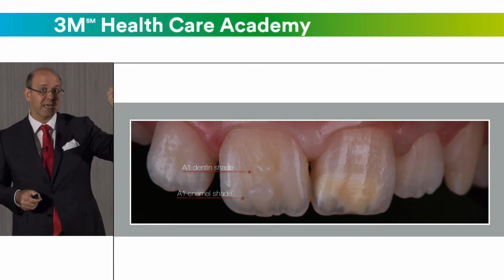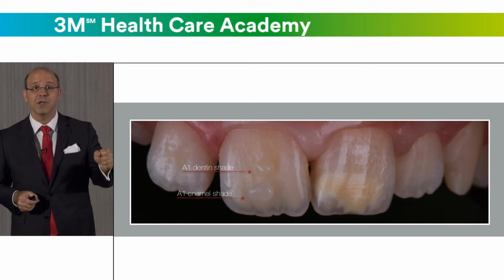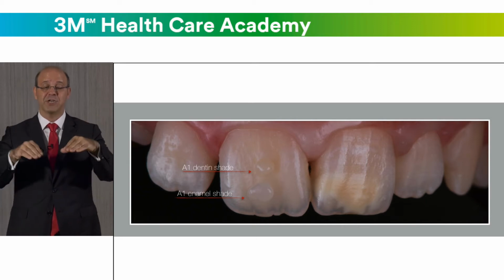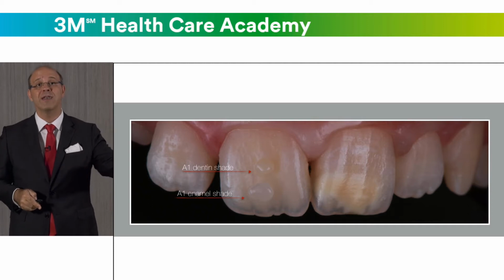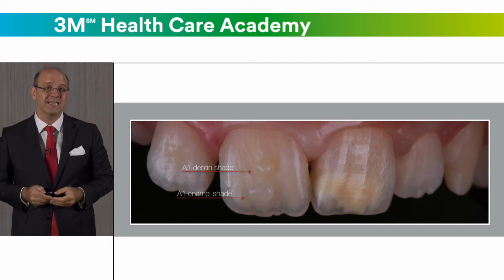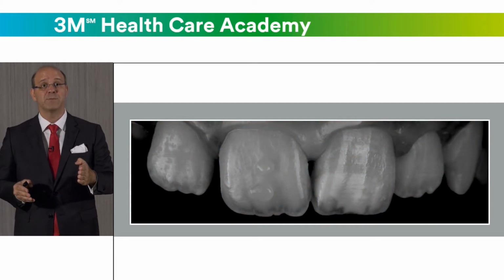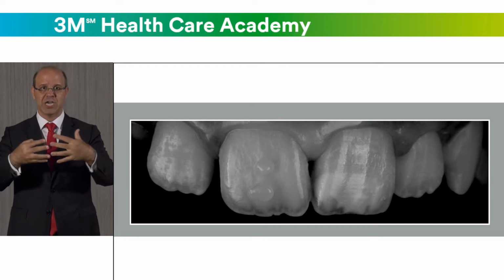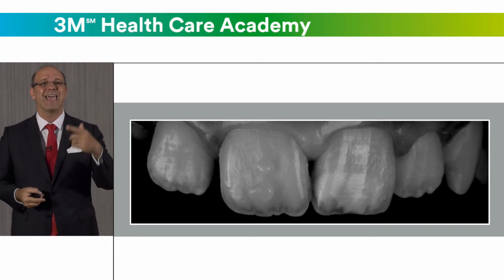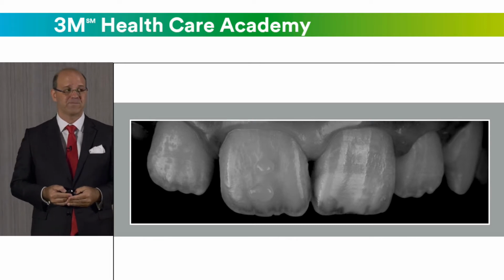You just place a small portion of composite with light cure, wet with water for the refraction index of the light, and we check which one fits better with that part of the tooth. Also, about the value, if you take a black and white picture, it's easier to check this kind of match, and even better if you use a polarized filter.